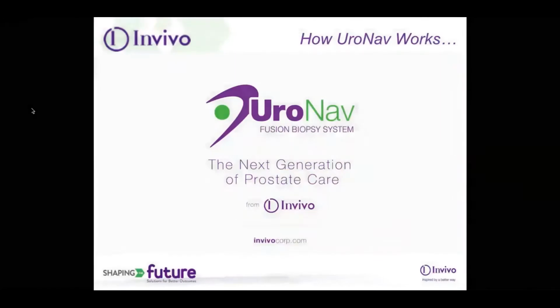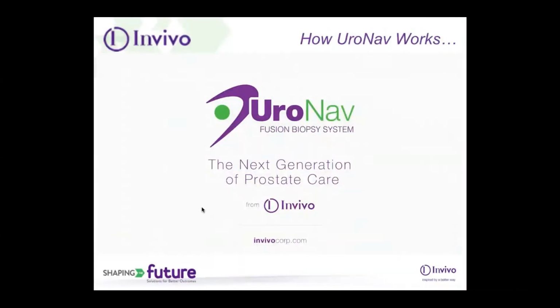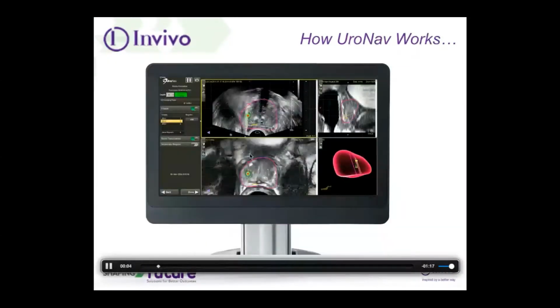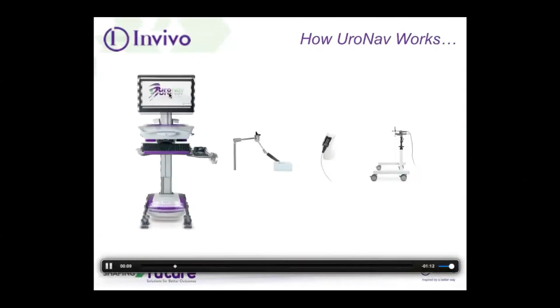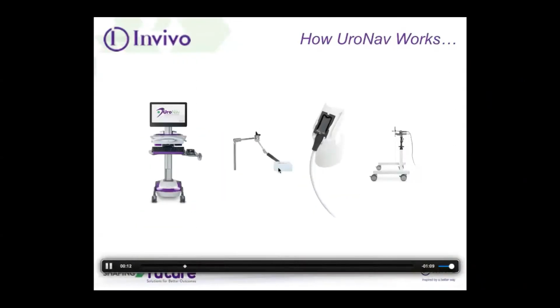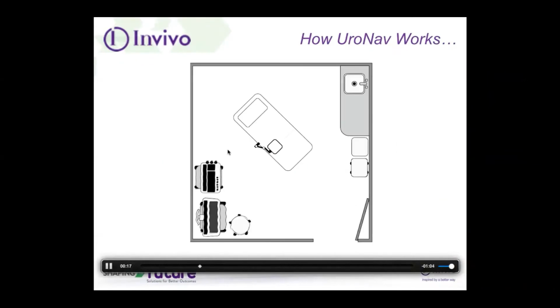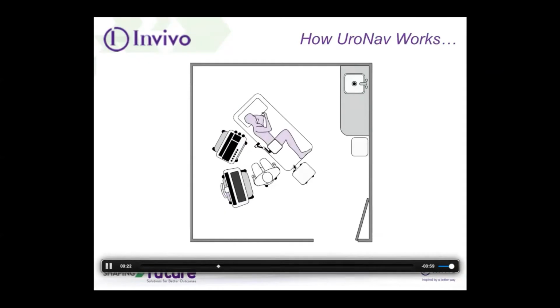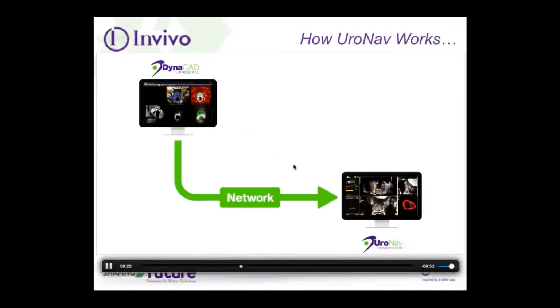So here's a short video showing what this UroNav system tells us. Basically, it's a combination of the MRI scan and the ultrasound that allows us to directly target an area of concern. You have an MRI scan that's marked and imported, and you have an electromagnetic connection between the ultrasound and this technology that in real time finds the tumor on the ultrasound matched with the MRI scan, to allow you real-time targeting at the time that you're doing the ultrasound, matched with the MRI scan that's imported into your system.